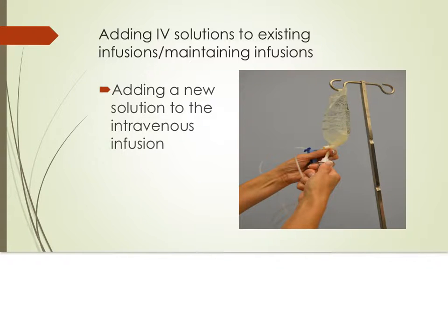When an IV is to remain in place with fluids continuing to infuse, another container of solution must be hung before the last solution container runs dry. The new solution is usually hung when the solution that is infusing reaches about 50 milliliters remaining. First, determine which solution is required next according to the orders. It is very important to check the physician orders as the type of solution could have changed throughout the infusion therapy.